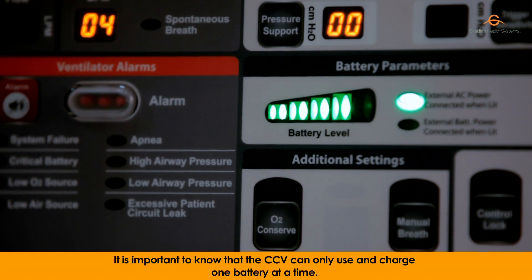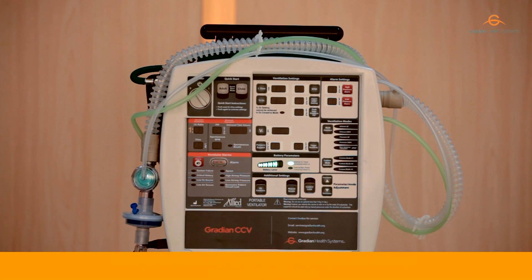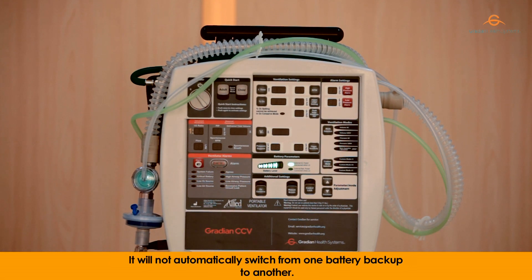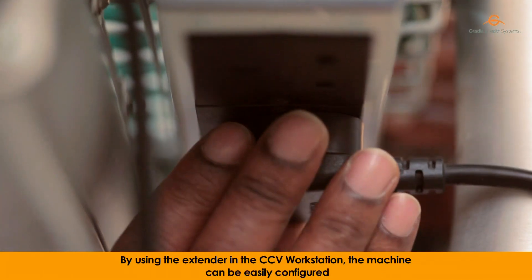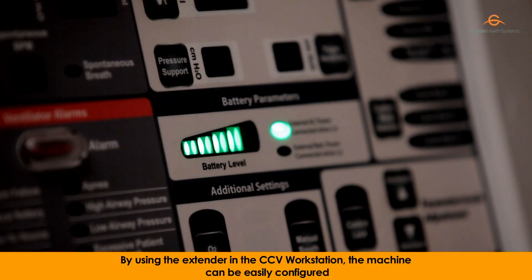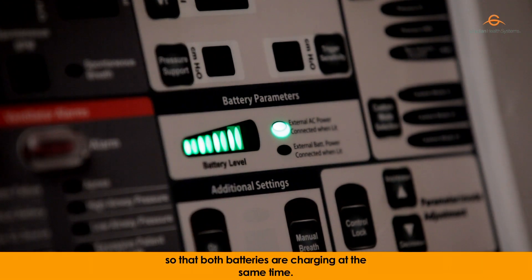It is important to know that the CCV can only use and charge one battery at a time. It will not automatically switch from one battery backup to another. By using the extender in the CCV workstation, the machine can be easily configured so that both batteries are charging at the same time.